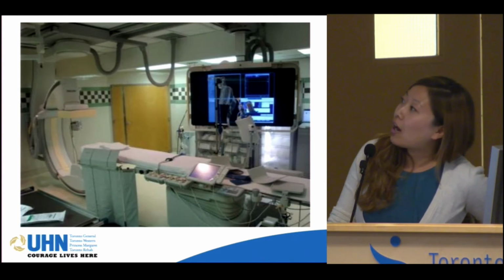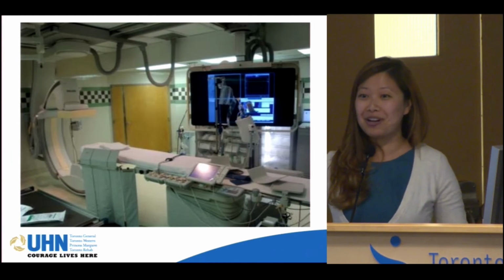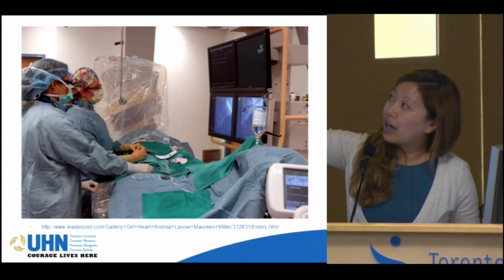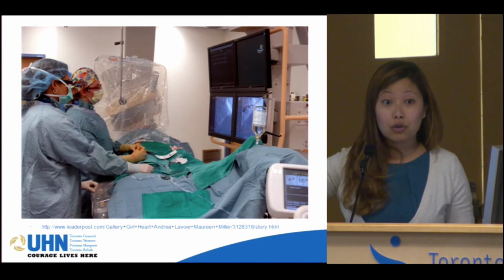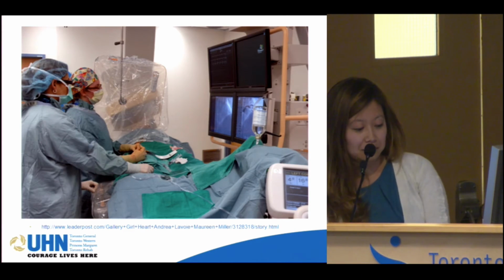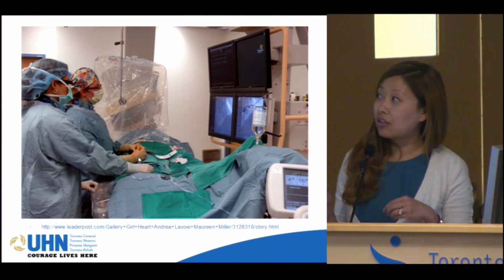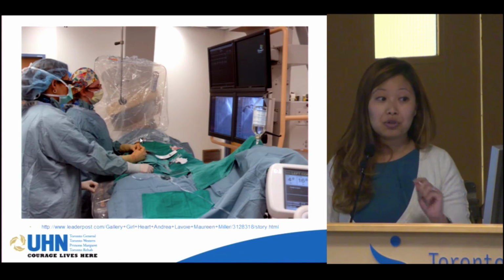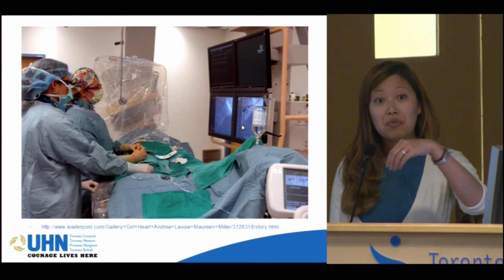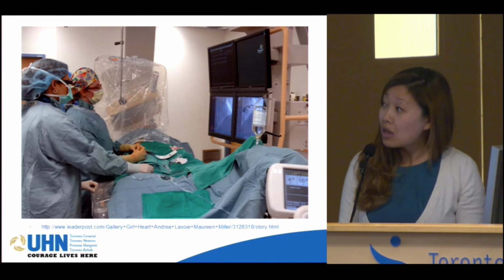So this is an example of how the room could be set up. Those of you who are lying on the table might not remember or see most of this. Lots of screens going on. The doctor's taking a look here, for example, at two screens that are taking x-rays throughout your test and procedure. If you take a look closer down here, they are actually inserting the catheter at that point and fishing it through. They can't actually see anything, but they rely on the x-rays, threading it through your heart, and then injecting the dye and then seeing any blockages if there are any there.